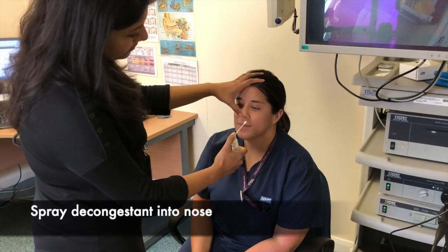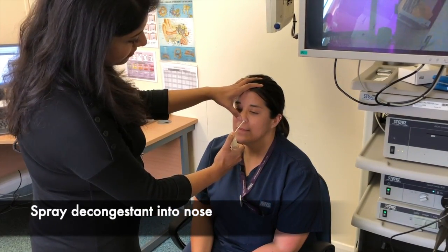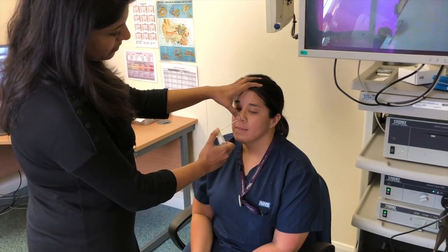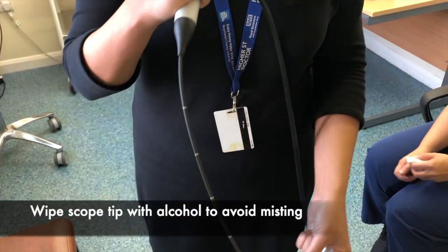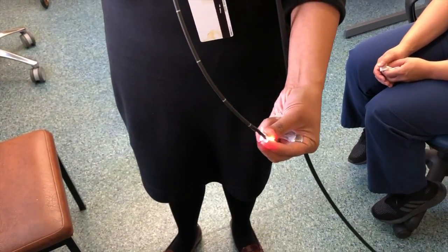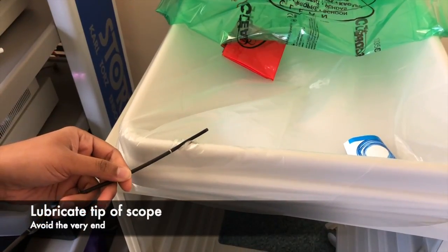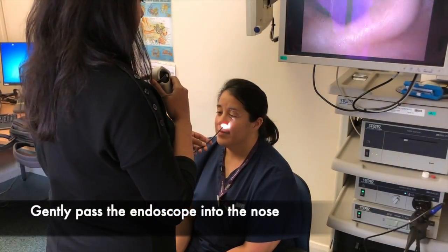First, position the patient upright and spray the decongestant into their nose. Ask them to gently inhale. Next, wipe the end of the endoscope with an alcohol wipe. This will prevent it from misting and lubricate the tip of the scope.